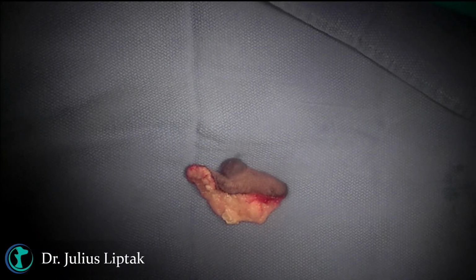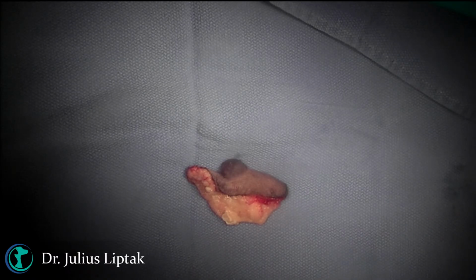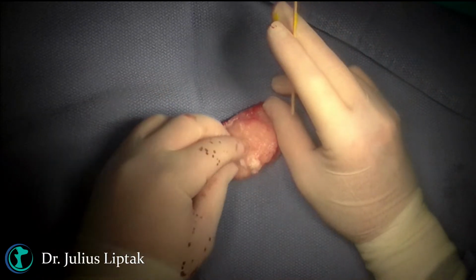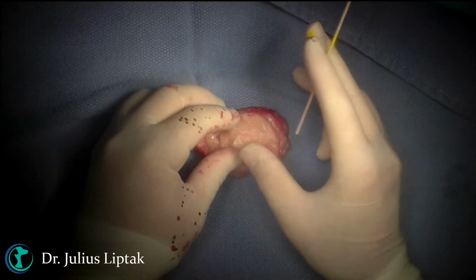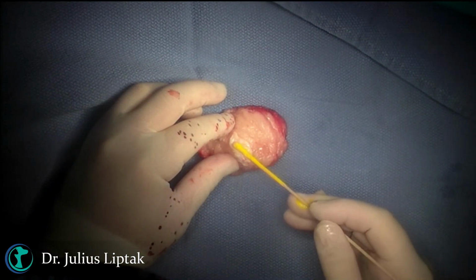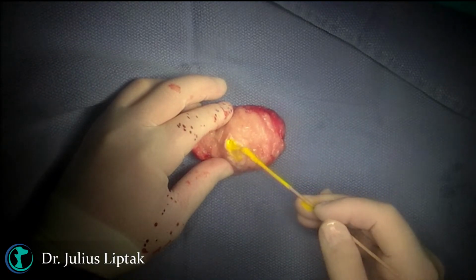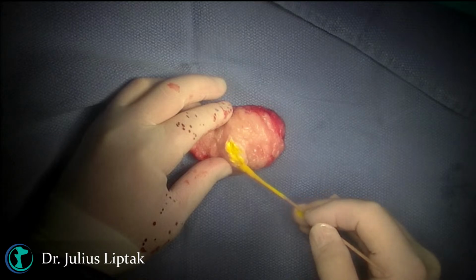Okay, so we're just going to ink this sample now. Our pathologist likes me to use yellow ink because it stands out quite well from the purple and pink of the H&E stain. So this is the deep margin that we're inking here.